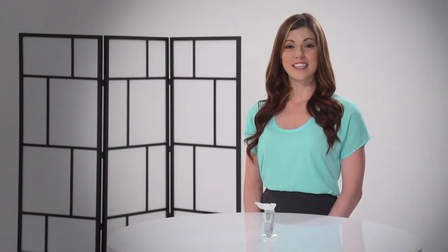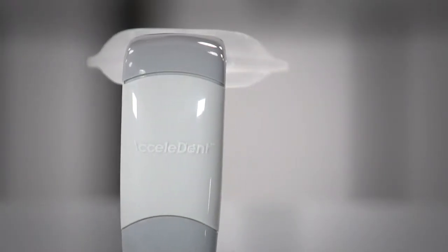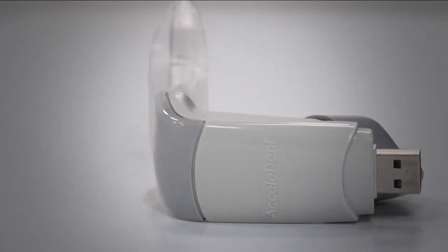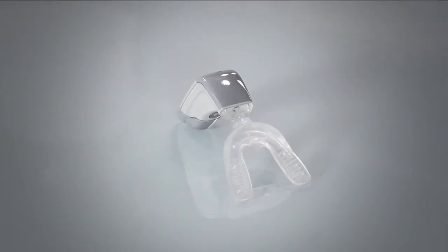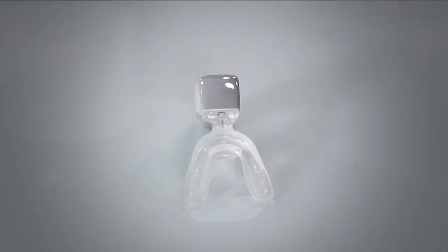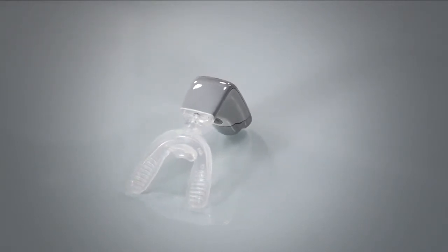Excelident Aura from OrthoExcel is a simple-to-use, hands-free device designed for faster orthodontic treatment. Excelident uses soft pulse technology to speed up tooth movement. It does this by generating small vibrations called micropulses to gently accelerate the movement of your teeth as they are guided by your orthodontics. These micropulses can also help make your orthodontics more comfortable.